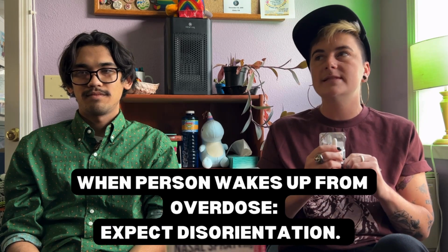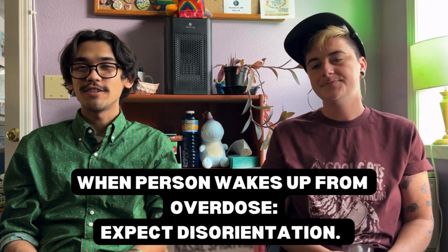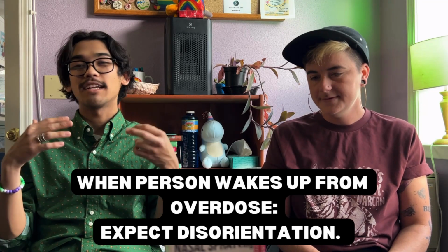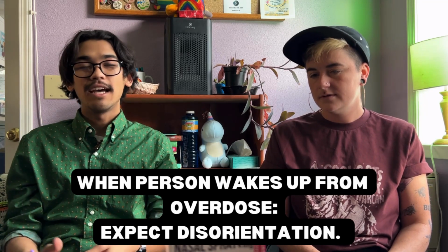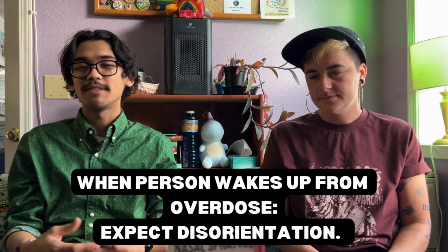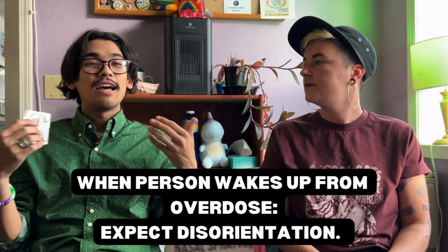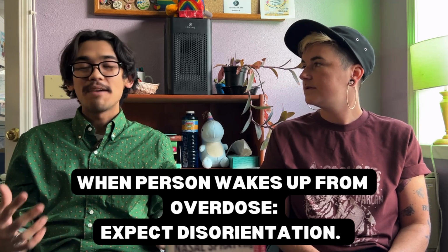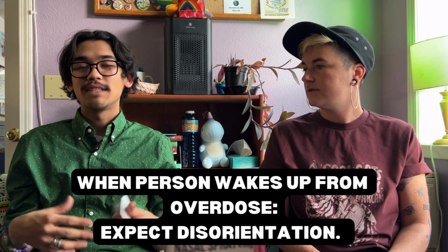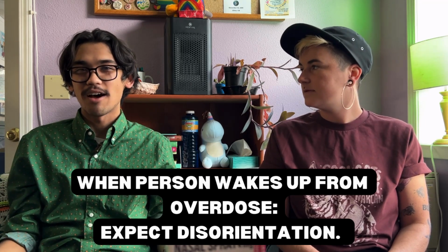A couple things once they wake up. When a person comes back from an overdose, they're going to be really disoriented because they aren't going to entirely know what had happened. The best thing to do is for you to stay as calm as possible and narrate that to them and say, hey, I noticed this, I gave you some Narcan, and just try to talk them through it. They might be a little angry, they might be disoriented, but the best thing to do is for you to stay calm and try to make the situation as positive as possible.